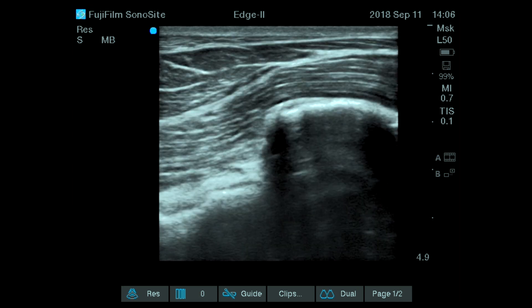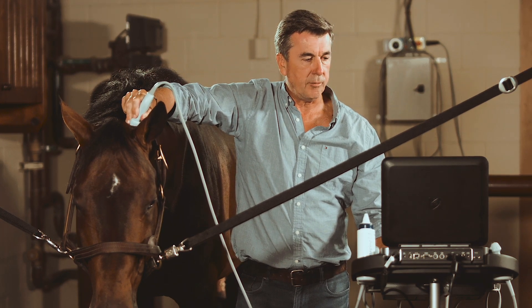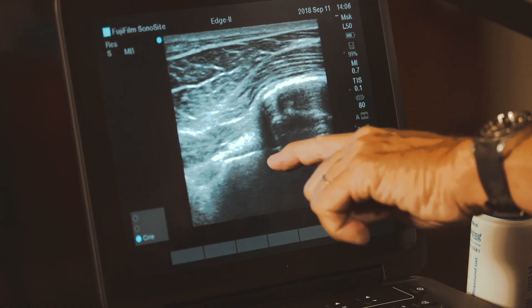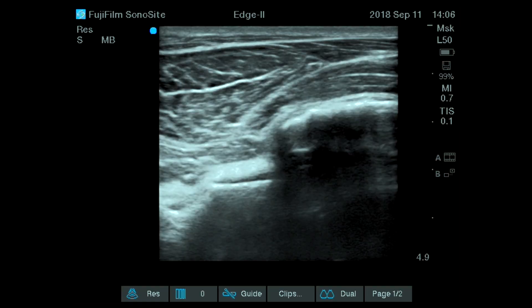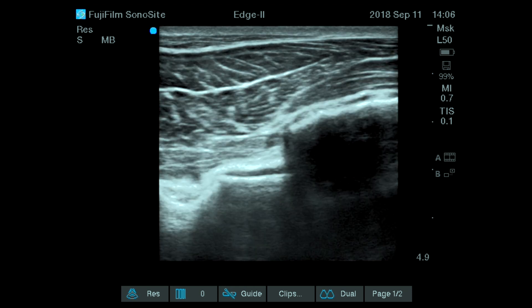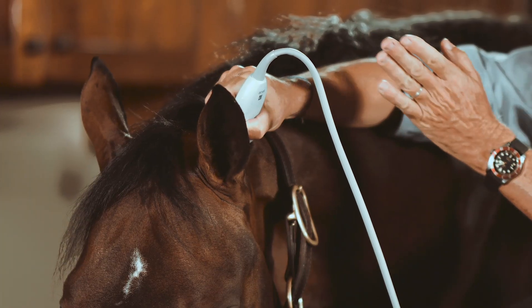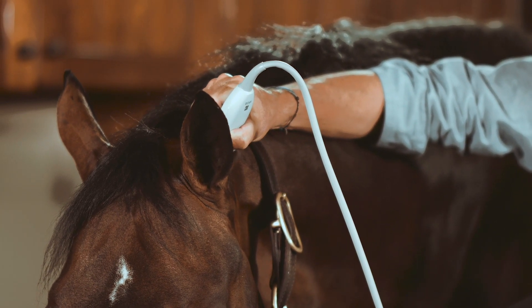We are talking about the atlanto-occipital joint, and this joint can be seen as soon as the probe is a little bit off the midline. You can play with your probe and some angularity to see that joint. We will make a few pictures to show you exactly the shape of that joint. You get a bit of a margin which is blacker here on the edge of the bone — this is the cartilage of the occiput. We can have a sharper picture as you fan your probe away from the midline to follow the joint between the atlas and the occiput.